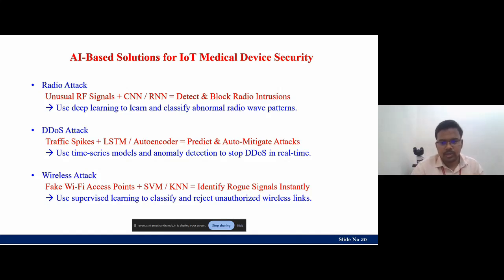Not only these five, there are so many attacks on medical devices. And nowadays new devices are coming into the market, and those are not fully tested. Even though they have been tested and have got proper certification from the FDA, they have a certain type of vulnerability, because the system is changing, our network configurations are changing, the usage of the internet is changing.